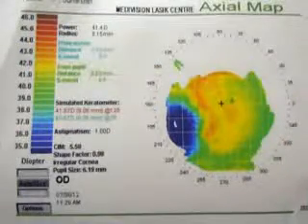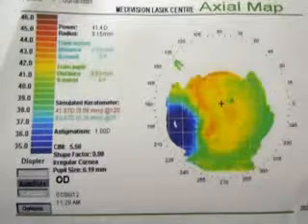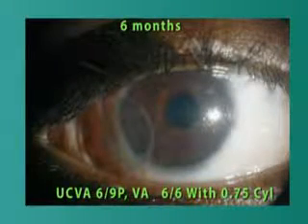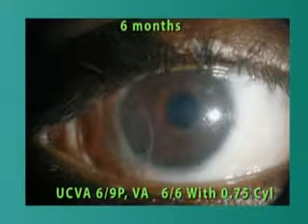Lamellar keratoplasty not only ensures gratifying results but is also a safe and effective procedure. We have seen no loss of visual acuity in any of our patients with limbal dermoid treated with excision and lamellar keratoplasty, which is truly gratifying.